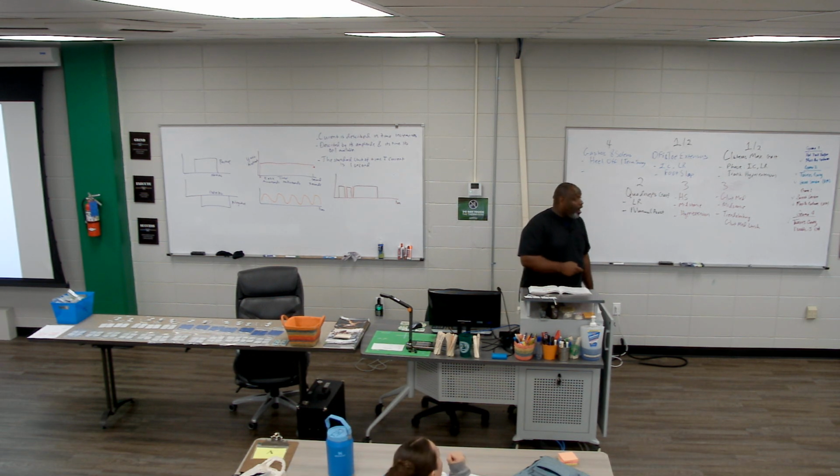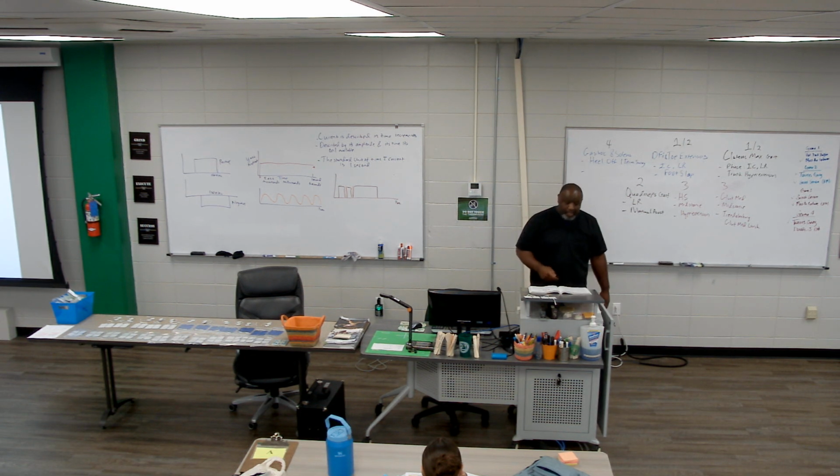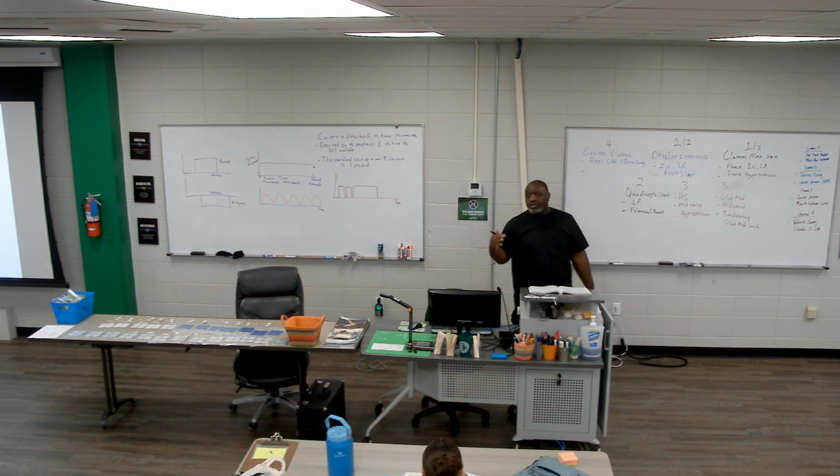And again, all of this is preset by the manufacturer. We don't get to dictate this, whether it's balanced or unbalanced, monophasic or biphasic. We can choose to use certain pulse currents, depending on what device, but we don't get to dictate how they're designed. That's done by the manufacturer. And just like with polyphasic, it's felt by your patient just like one pulse. So your patients won't know the difference. You will, and you'll choose certain things based on what your goals are.